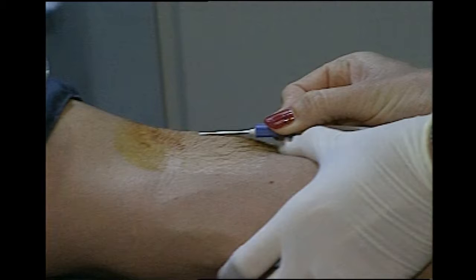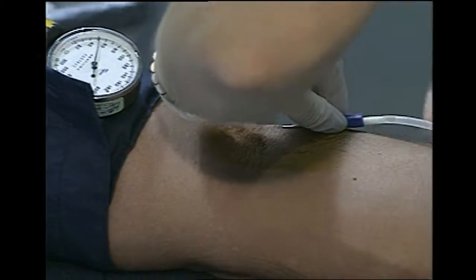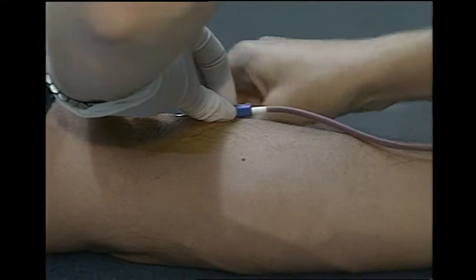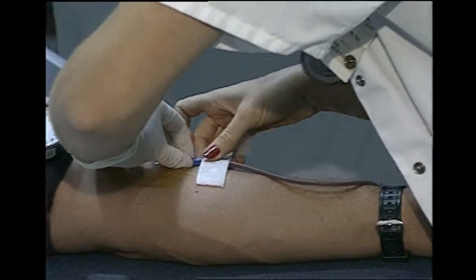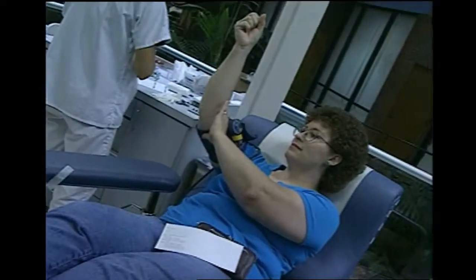Now, this is where some of you might get a little squeamish, so if you need to close your eyes, go ahead. The rest of you can open yours. Both eyes. That's better. The needle is inserted, and the blood begins to go through the tube into a plastic bag where it's stored. You're asked to either squeeze or roll a tube to help the blood pump out easier. Once they have their unit, they close off the tube, take out the needle, and it's over.